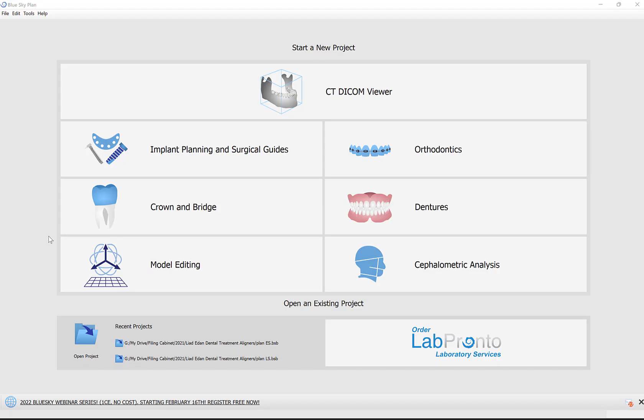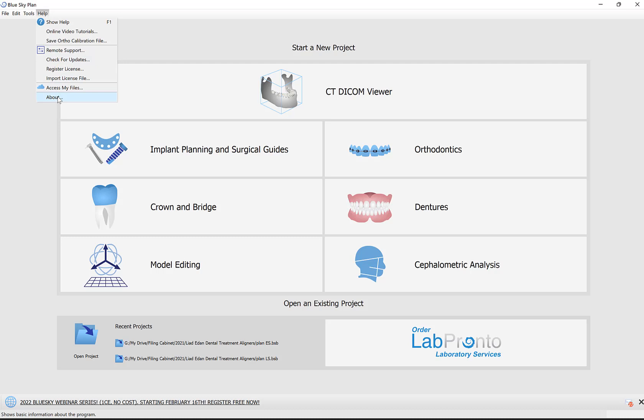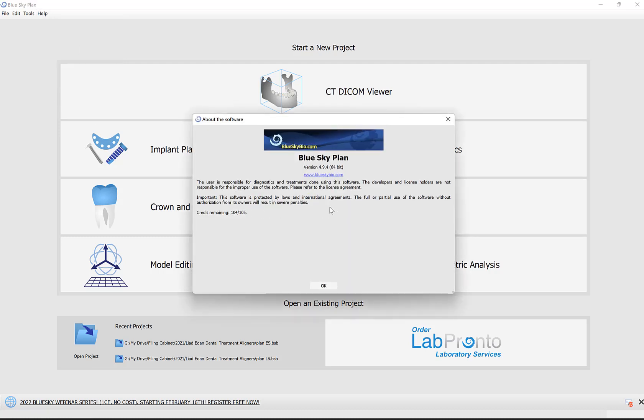Hello everyone, this is Michael from Blue Sky Bio. In this training tutorial, I'm going to demonstrate how to create a crown for a titanium sky-based abutment. I'm using version 494 of the Blue Sky Plan software.